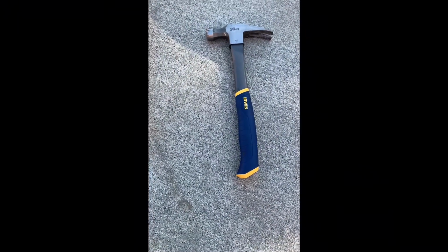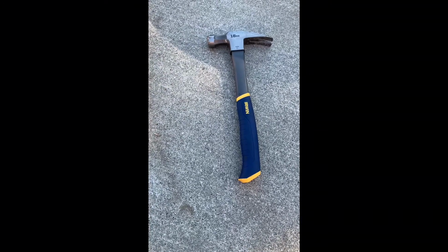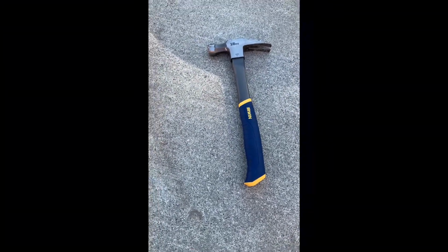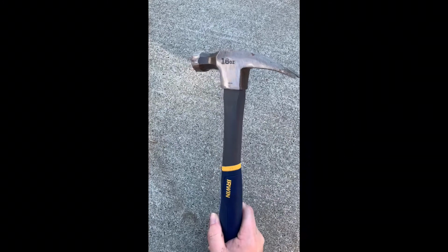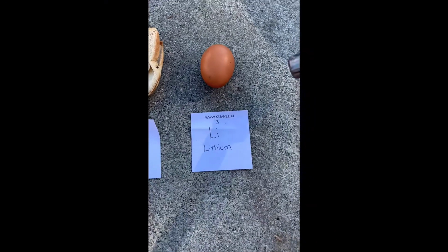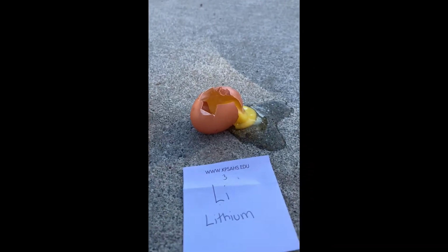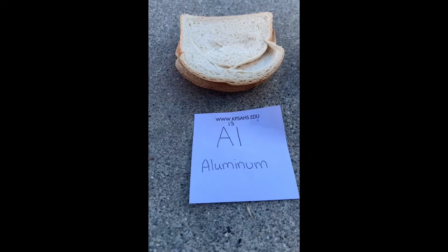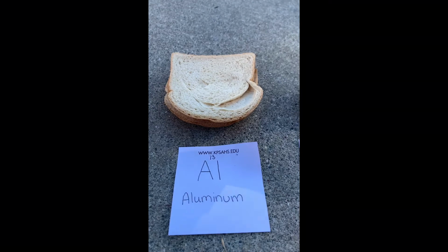Next, I'm going to be demonstrating for you what the interactions would look like between the incoming electrons with different elements of lesser atomic numbers. So this hammer is going to be representing our incoming electrons from the cathode. And up first, I'm going to demonstrate for you what that interaction would look like if our anode, our target material, was made of lithium, which only has an atomic number of 3. It would crack like an egg. Next, I'm going to show you what the interaction would look like if our target was made of aluminum with an atomic number of just 13.